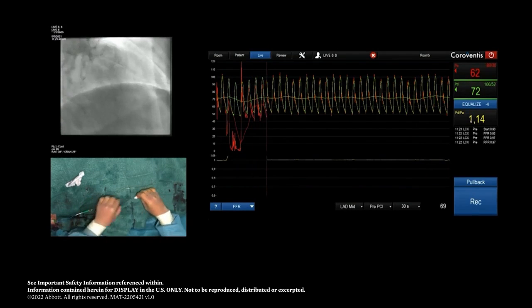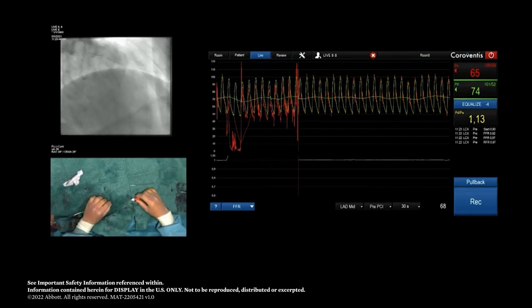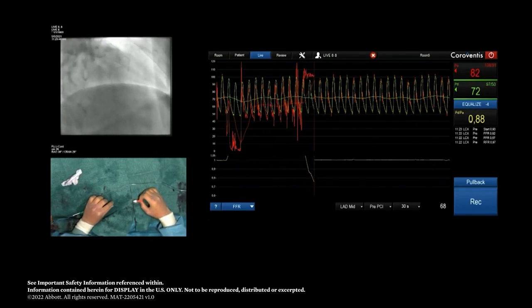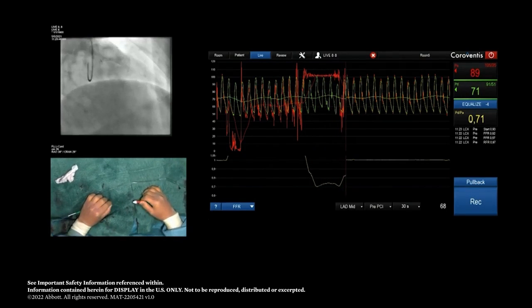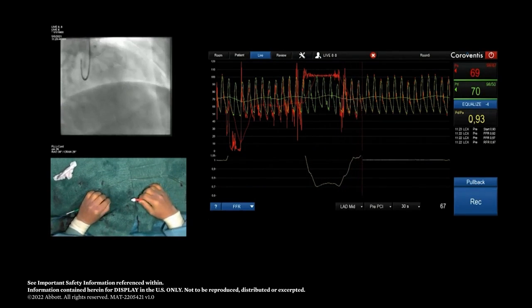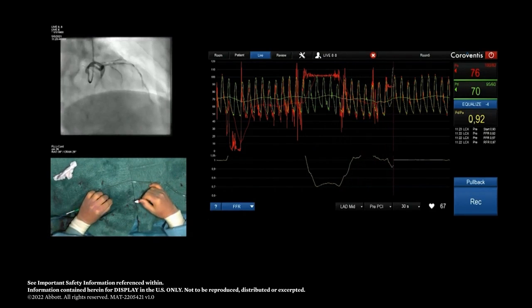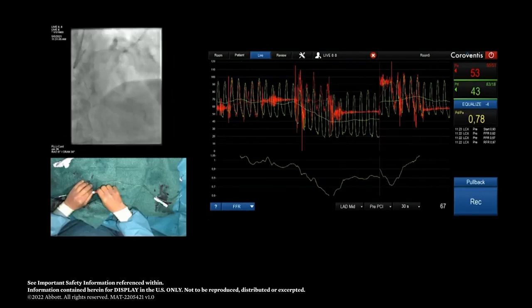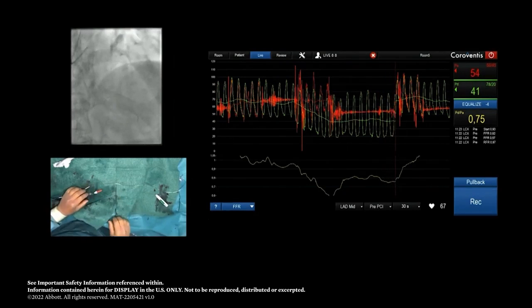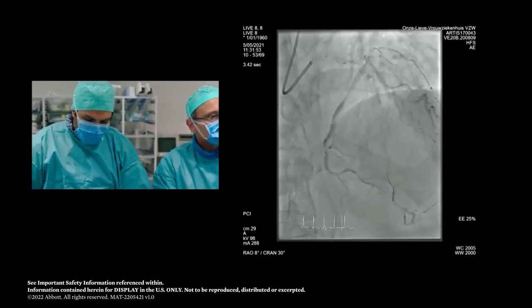You know, when we do this exercise, what we like to do is flush the guiding catheter from any residual of contrast medium. There is some tortuosity there. I will do very gentle movement. And of course, there are lots of septal branches and diagonal branches on the way. We try to avoid visiting all of them. There we go. I think we are good enough. Good. So we have positioned the wire distal in the vessel.